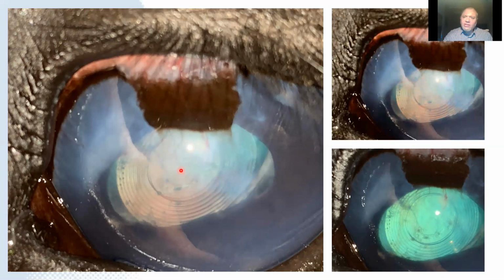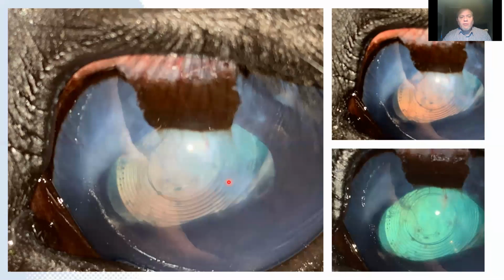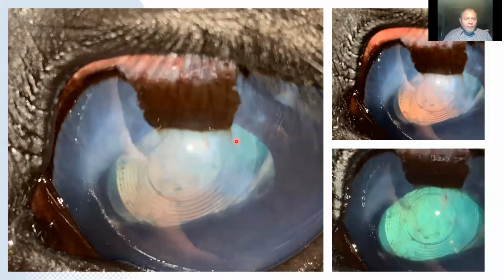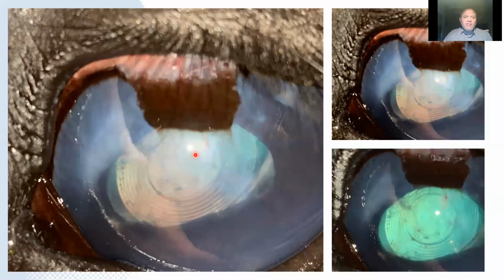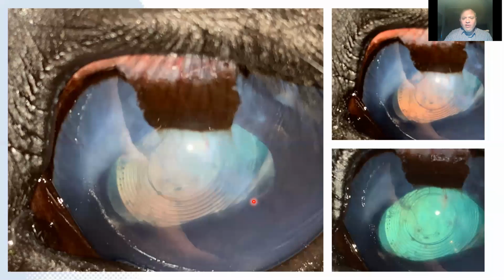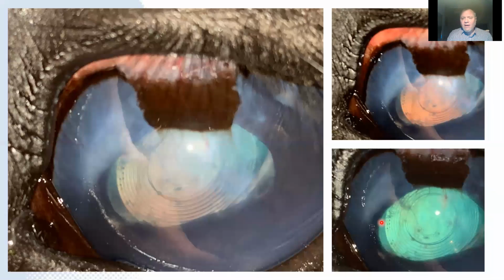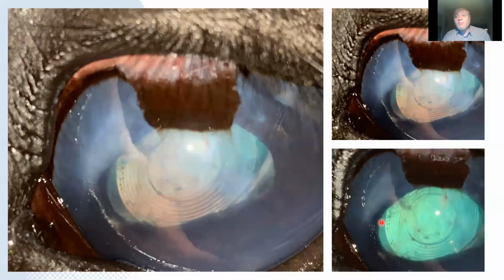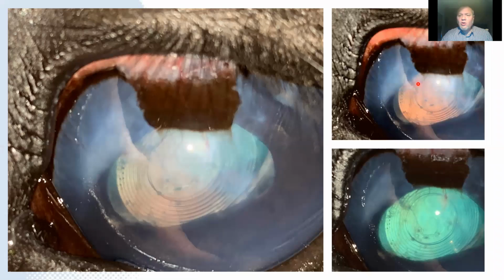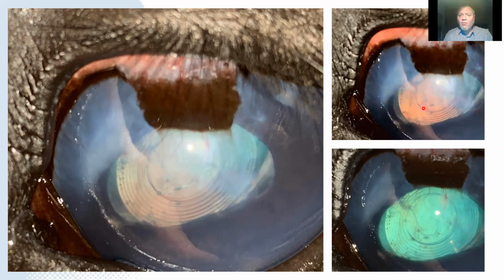This is another background patient. This horse has had a corneal transplant, a CCT, to repair a penetrating wound in the cornea here. Some scarring, but largely transparent. It also perforated its lens at the same time, so had both its cornea repaired and its lens replaced. Taking photographs from different angles allows us to get much more information about the likely effect on vision and the progress of the case, rather than a single image. And this top right stacked image shows you quite nicely how we can get a lot more information with these multiple images in a single one.